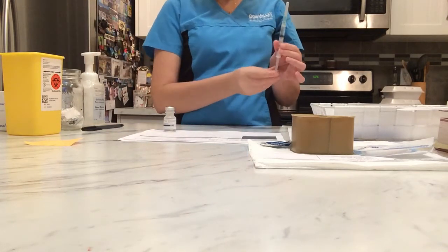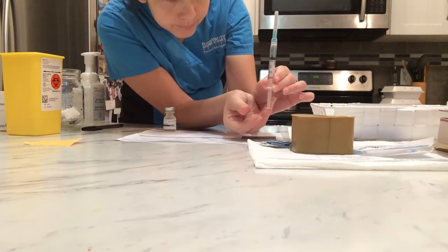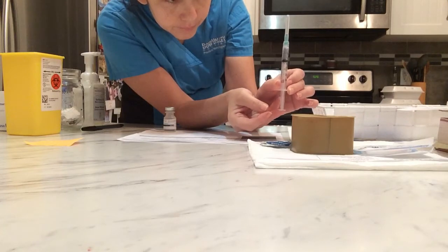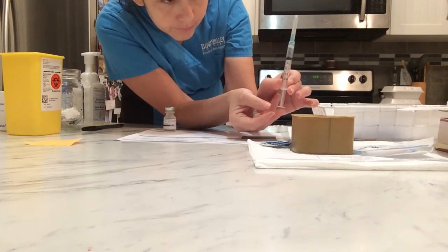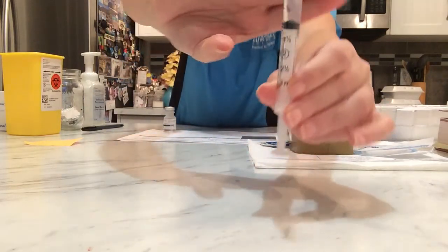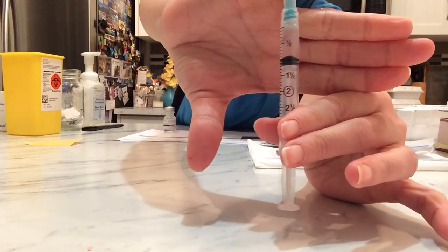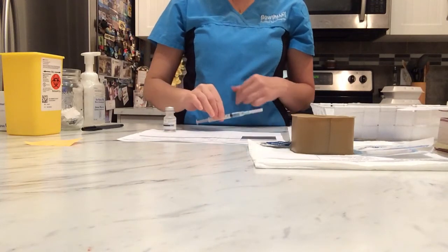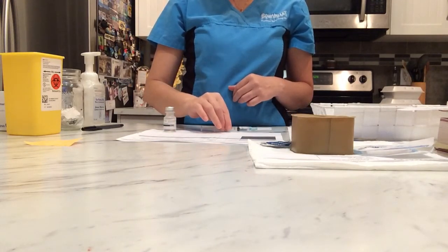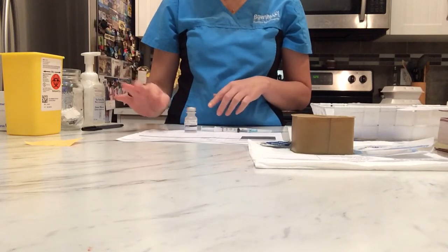Garbage. And I'm gonna make sure I have 1 ml. Okay. Now that I have my medication ready, I will do a second check with my medication, the withdrawal, and the MAR.